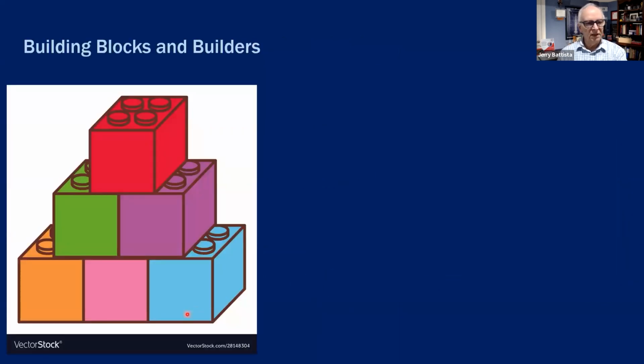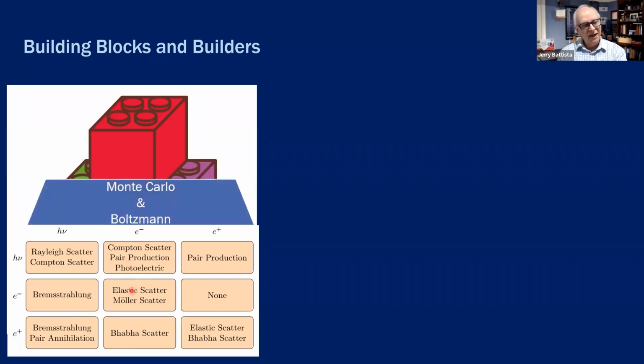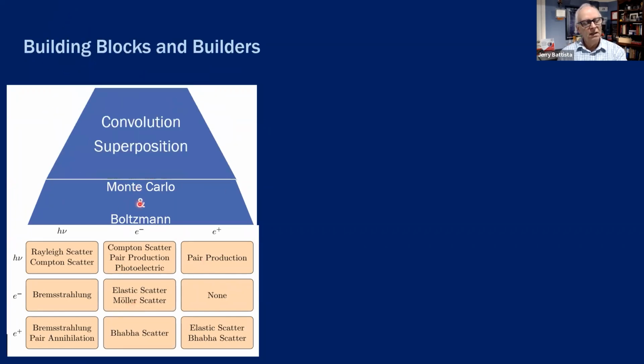If we look at the building blocks, the real building blocks are the interaction cross sections: Compton interactions, photoelectric effect, etc. And then building on that, the Monte Carlo and Boltzmann methods rely on these cross sections. And finally, an approximation to these methods is the convolution superposition method. So these are all built together.